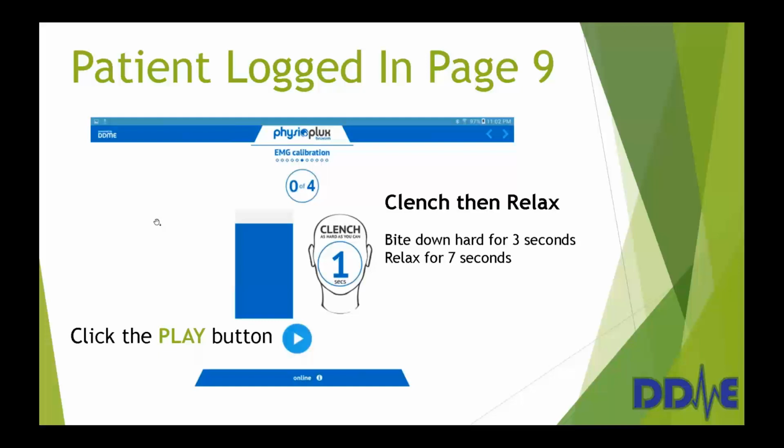Okay, so then when you click swipe from the finger probe and oximeter slide, this is where we do a waking bite force test, and you click the play button. It's the kind of lighter blue button with the triangle, and once you start that, you just watch the guy's forehead, and it's going to say clench or bite down as hard as you can. Once you get to the first clench, you'll see that blue bar go up.